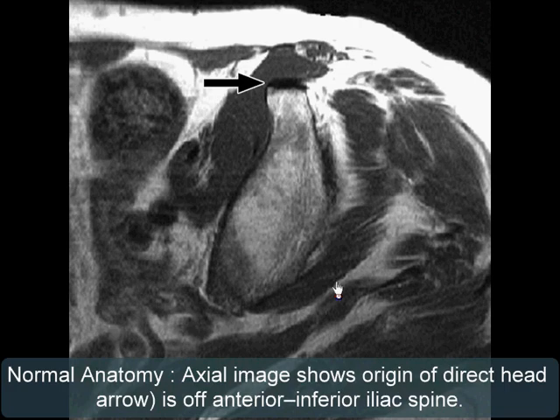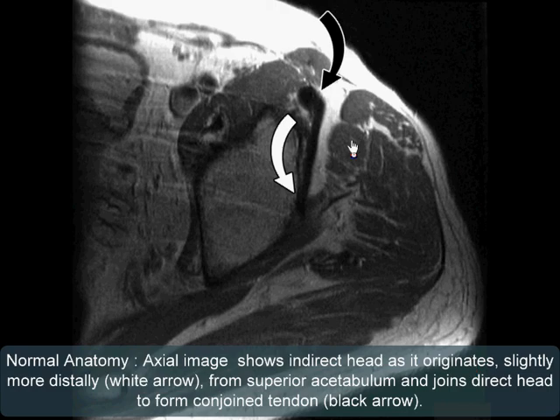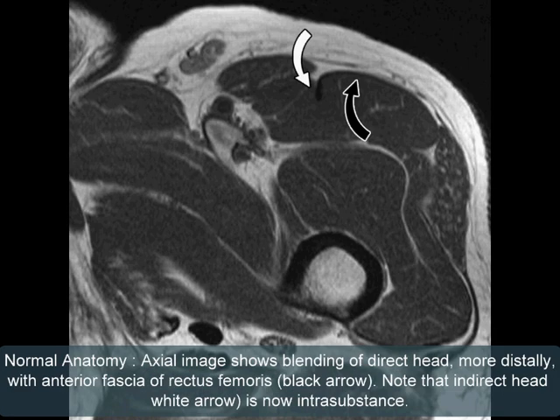Axial T1 weighted image with normal anatomy showing the origin of the direct head at the anterior inferior iliac spine. This axial image shows normal anatomy with the indirect head originating from the superior acetabulum and joining the direct head to form the conjoined tendon. More distally, the axial image shows blending of the rectus femoris with the indirect head now intrasubstance.